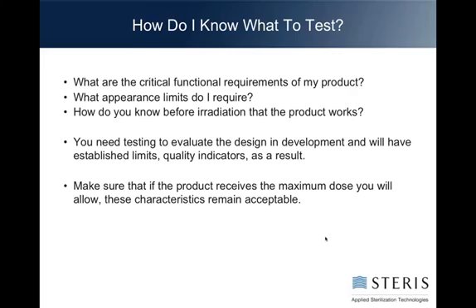Do I have appearance limitations? For example, what if I have to shine a light of a particular wavelength through a product? If my product was to discolor or darken, maybe I obstruct that light. Or maybe I have to be able to see something when it goes into solution. So the physical properties also have to be considered, as well as the appearance.